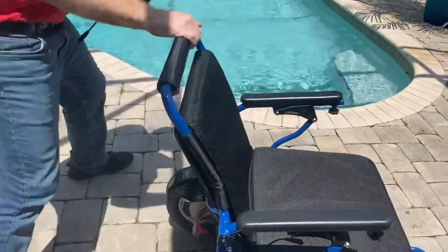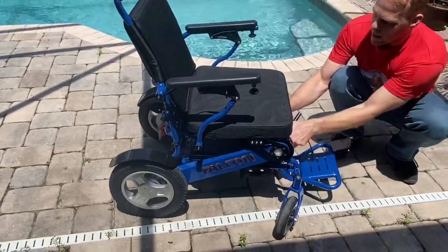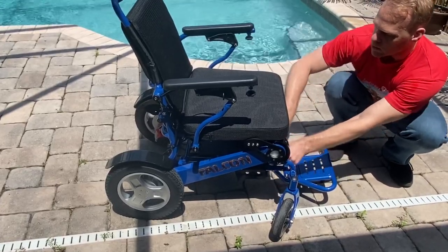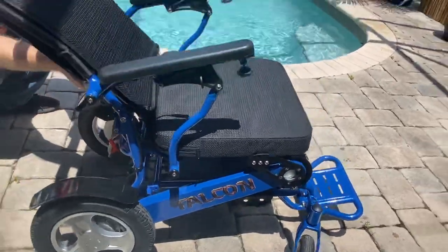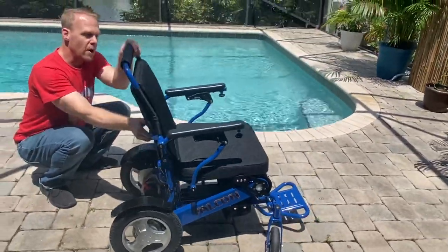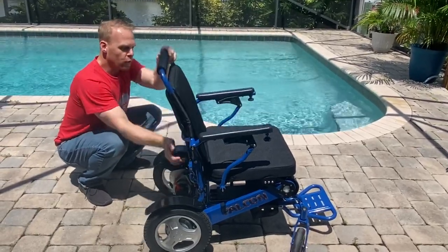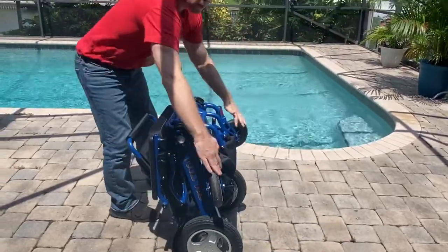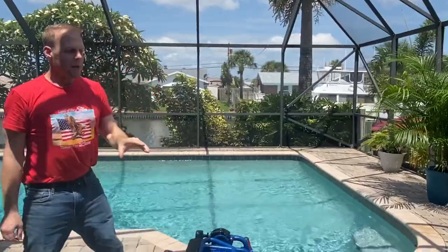It was a great deal of fun giving an overall review on a nice day about the Falcon reclining ergonomic power folding wheelchair — how easy it is to fold, unfold, and utilize. Thank you so much for watching, folks. Make it a wonderful day.